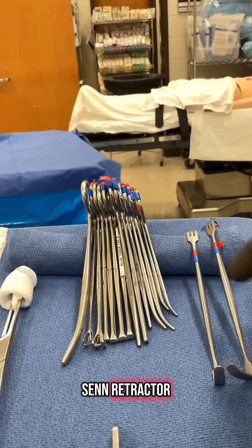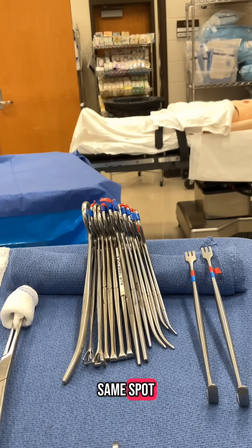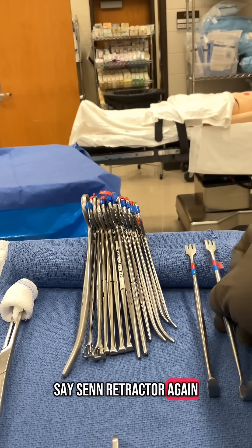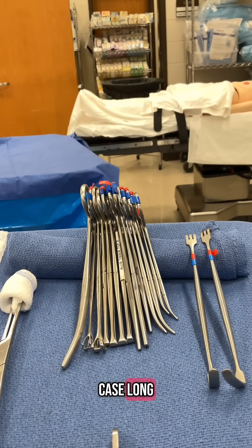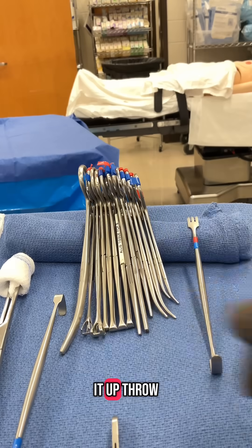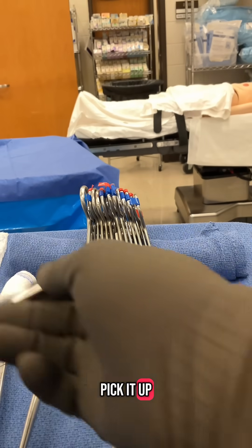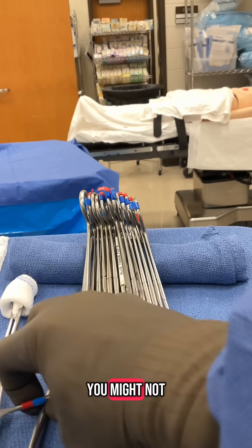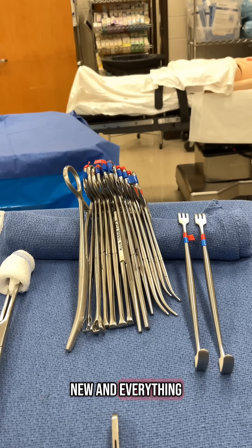If they ask you for a Senn retractor, pick it up, hand it to them, they give it back — same spot. So when they ask for a Senn retractor again, you know where it was because it's been in the same spot all case long. If you pick it up and throw it down somewhere else and it keeps moving around, then they're jumbled together and you might not know where they are.